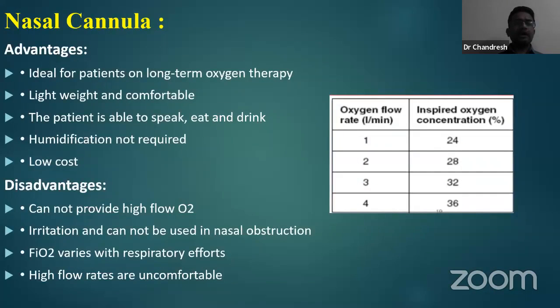If you look at the nasal cannula advantages and disadvantages, it is ideal for long-term oxygen therapy. Many patients on chemotherapy or palliative care will be on nasal cannula. It is a very lightweight and comfortable device. The patient can speak, eat and drink. Humidification is not required, because whatever oxygen is going through the nasal cavity has to go through the nose and the nasopharynx, and then it will enter the trachea. So natural humidification can be expected with a low flow rate, and definitely the low cost is another additional point.